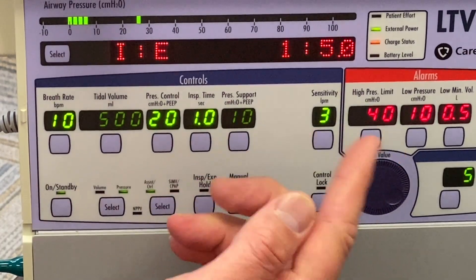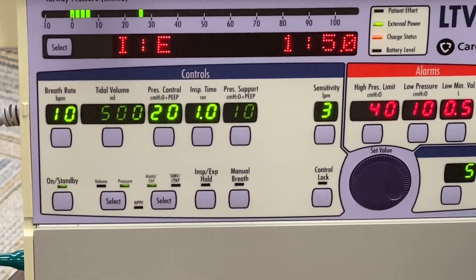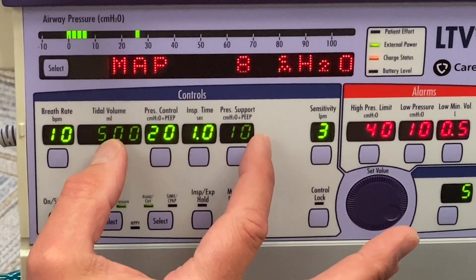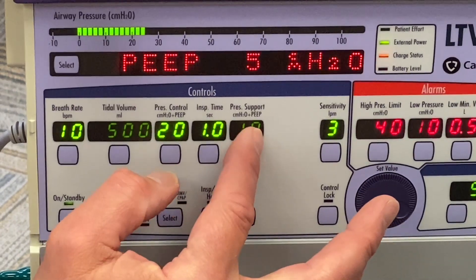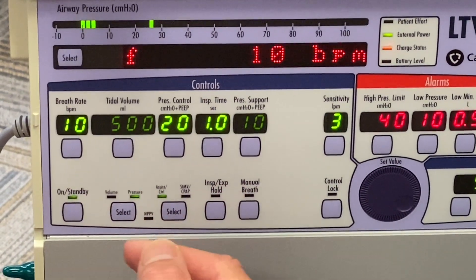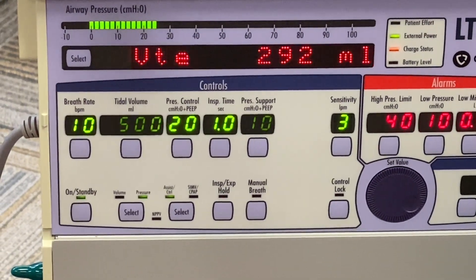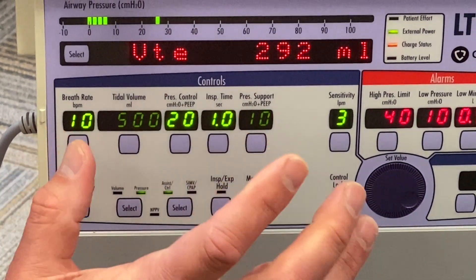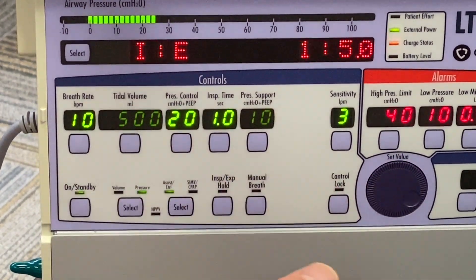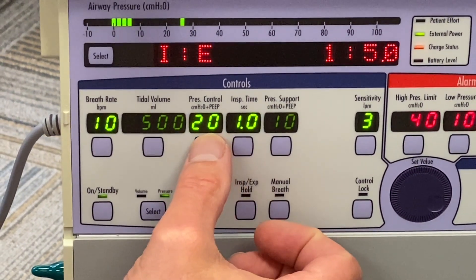The change is accepted and all your controls come back into view. You can see that volume and pressure support are shown very lightly — those are not controlled in this current mode of ventilation. Anything that's not applicable for the mode you're currently in will be shadowed.